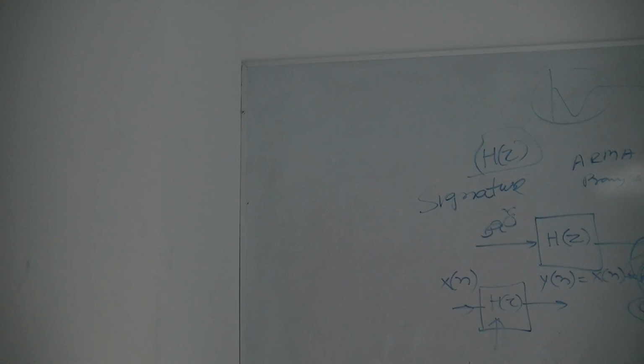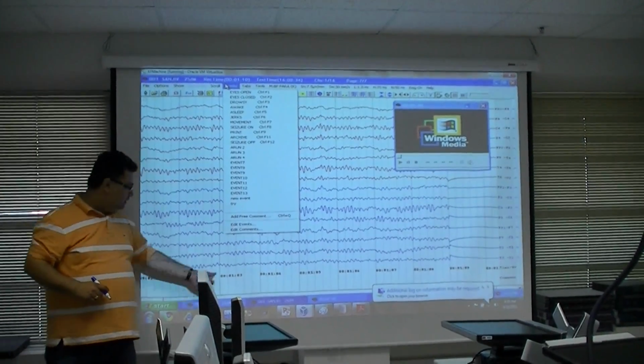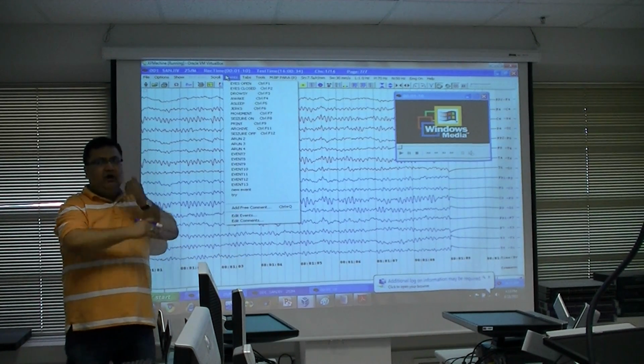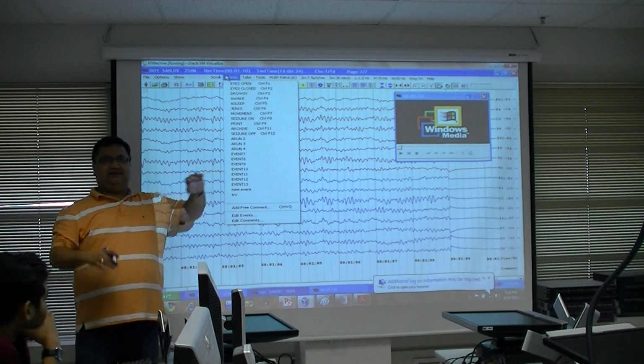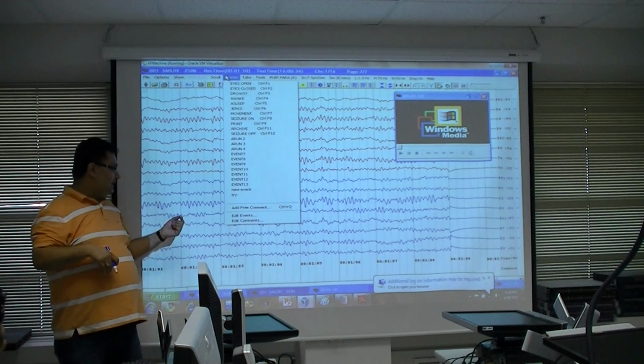I mean, if for example we switch the second and the first one. The thing is that suppose we flicker eyes here, so I can take data from here to here, say 1.02 to 1.04. I need not take all the data. The reason is that most of the time there is no function. He's just looking constantly. So as soon as he flicked his eye, I just took that.